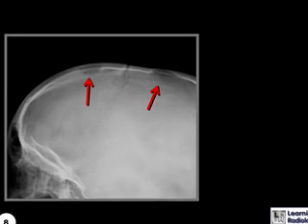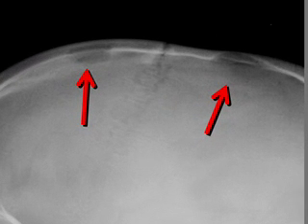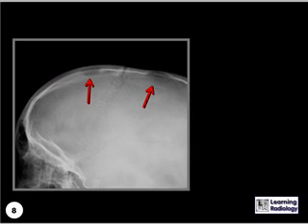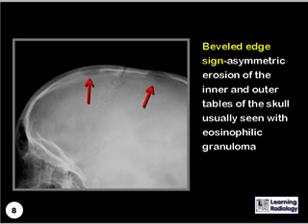What sign is demonstrated here? That's the beveled edge sign, which is the asymmetric erosion of the inner and outer tables of the skull, usually seen with the eosinophilic granuloma.